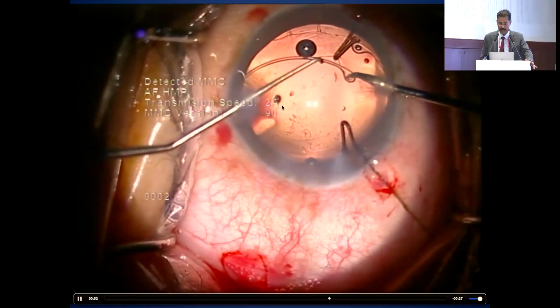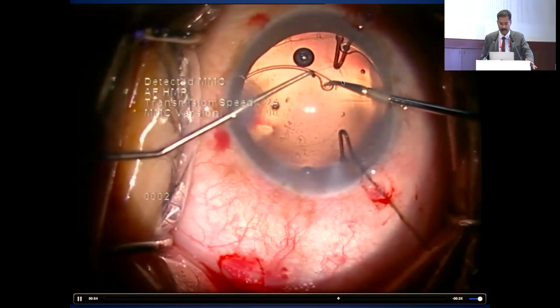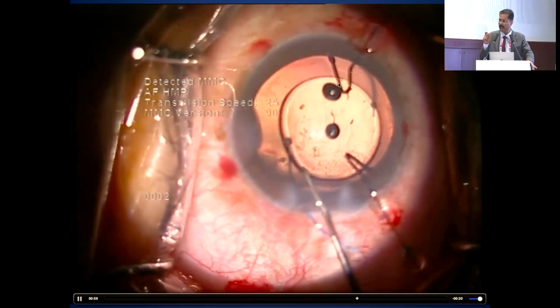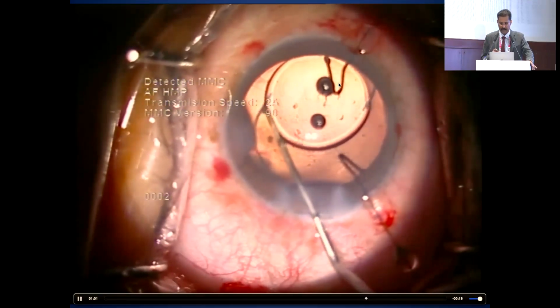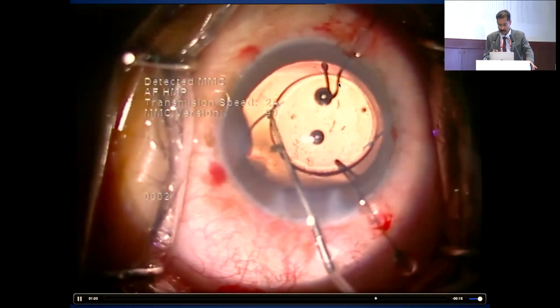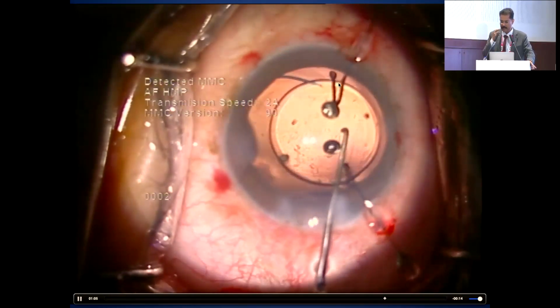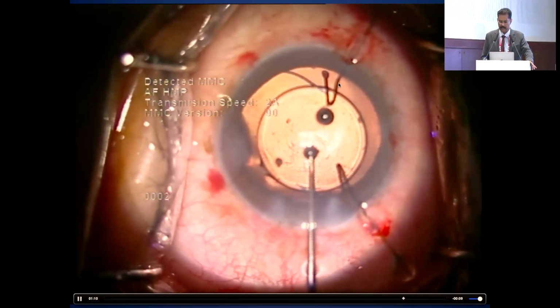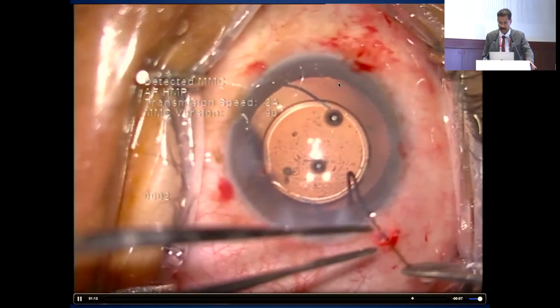So once the rhexis goes inside, I use this forceps again. As Dr. Amit was telling, use of these micro rhexis forceps is very, very important and crucial. Please have it in your armamentarium. And after placing the CTR, I release the hooks and then place the lens in the sulcus and then capture it into the rhexis margin if possible.